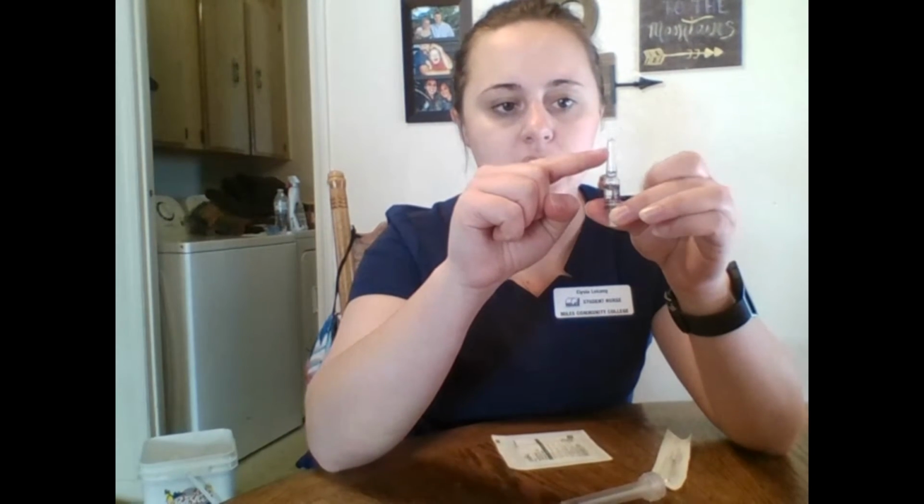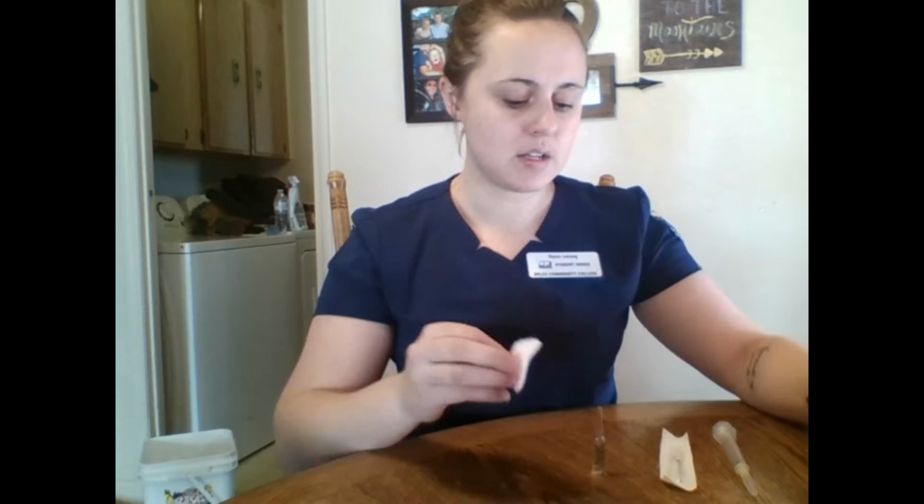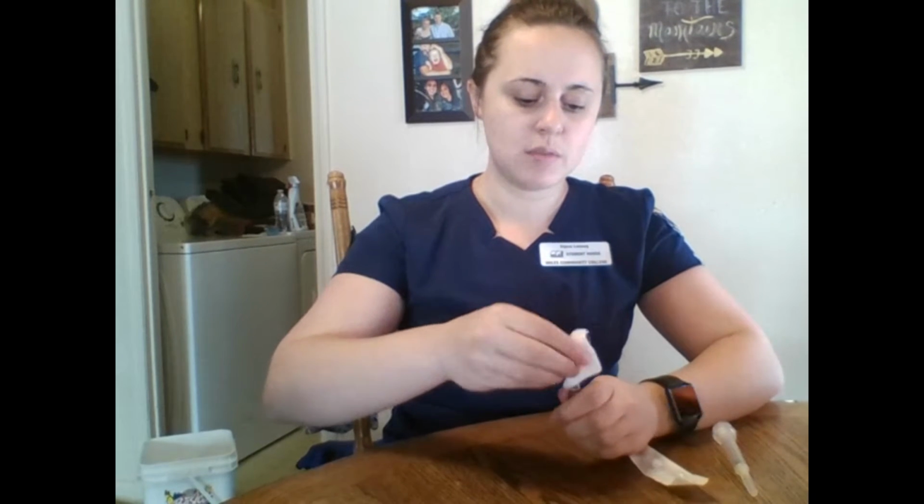It's still good. I want to make sure that all the medication is out of the top part of this, and that's what I was just doing right there. And it's in the bottom. So I'll go ahead and break the top, and I want to use some gauze, and I want to make sure that I break this away from me like that. And we'll just set that there.